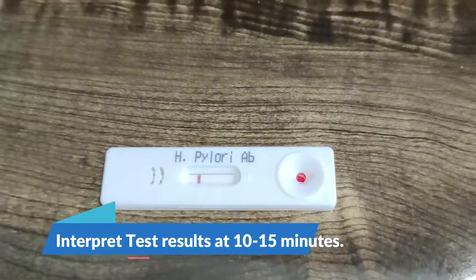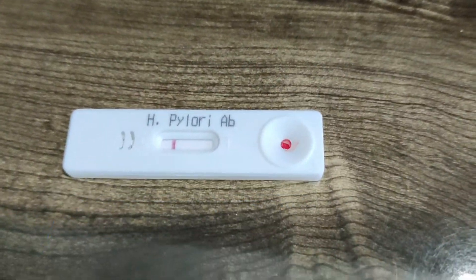Now you can see the clear band appearing on the cassette. It means it is only showing the control line.